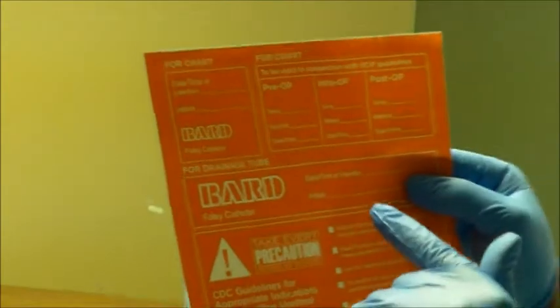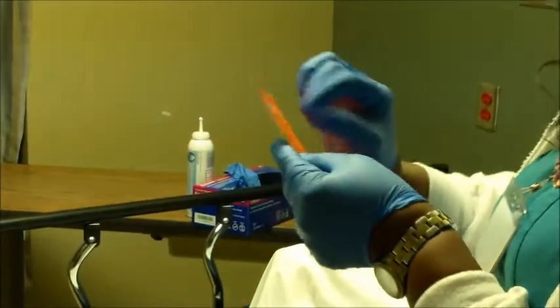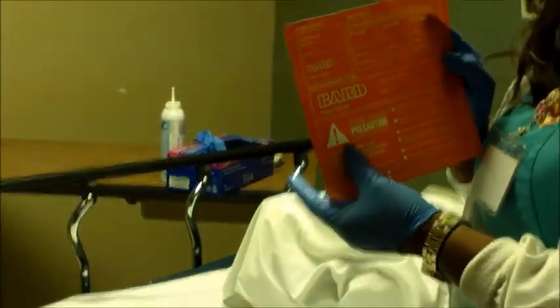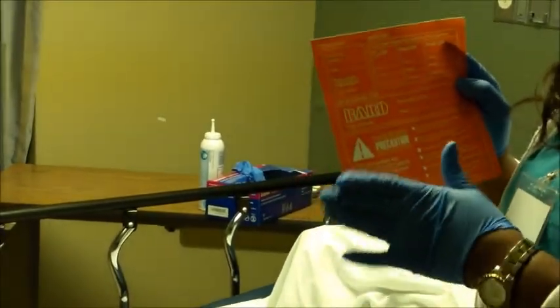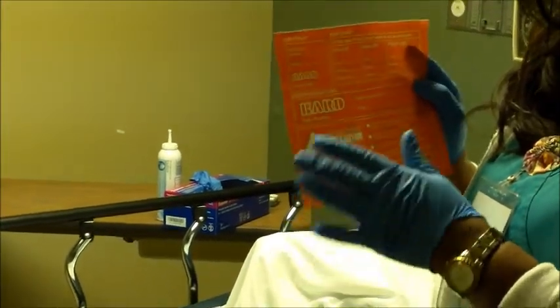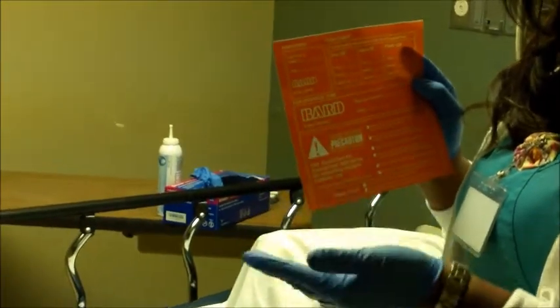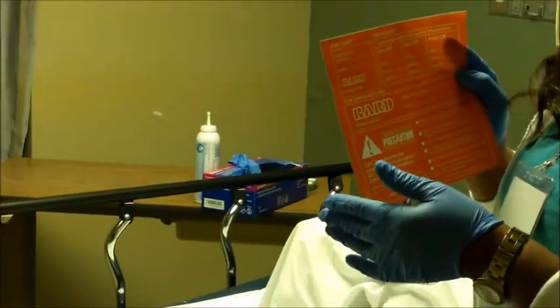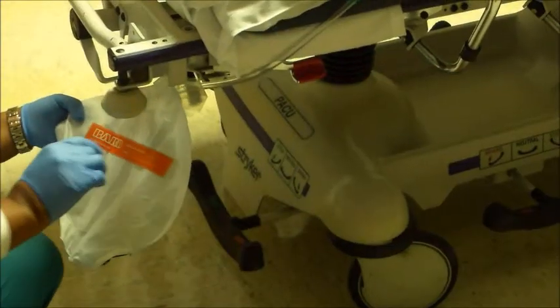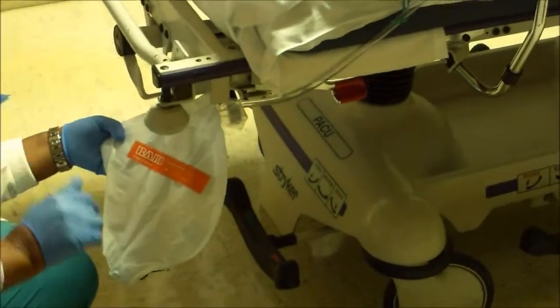I want to make sure that I do a date, time of the insertion, and my initials as the RN. I want to do it for the chart as well as for the drainage tube. So I want to make sure I do my date for today and initial it. And for the chart, I'm going to place this in the progress notes, or based off of what facility you're at, try to find out whether there are protocols as far as documentation of a Foley. Some are electronic as well as paper charting. And on here for the tubing, make sure that it's dated, timed, and has my initials.